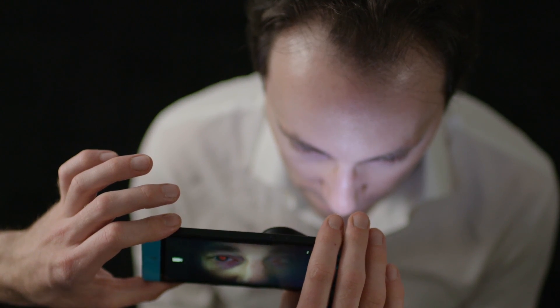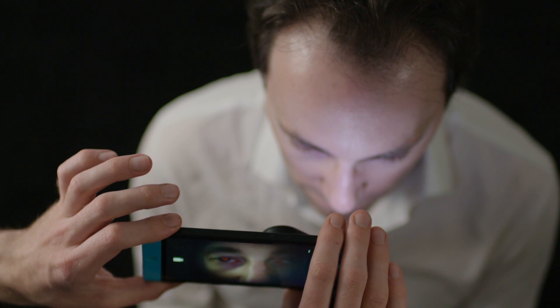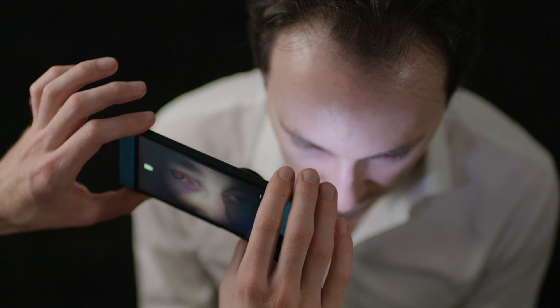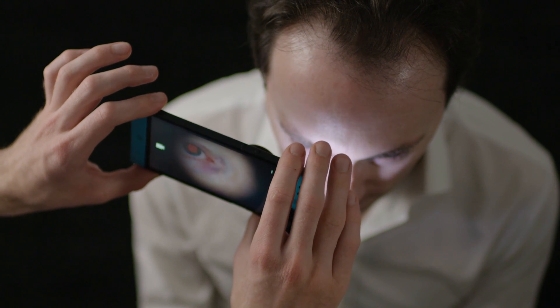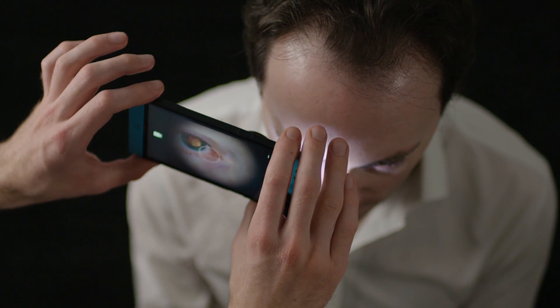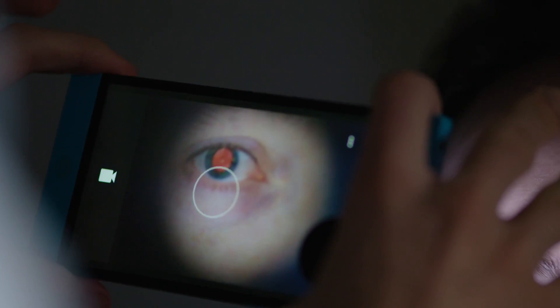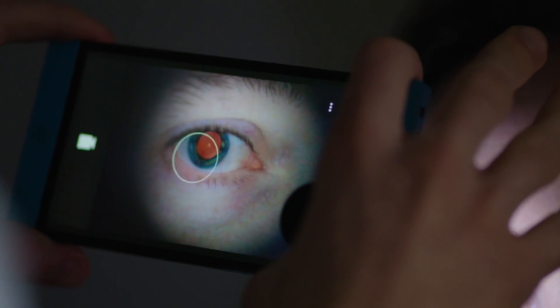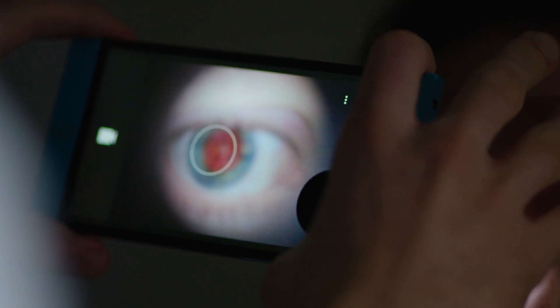Start 50cm from the patient. With the patient looking straight ahead, approach from a 30 degree angle. Ask the patient to focus on something behind you so that their eye keeps still. Move the phone forward, looking for a red-orange light reflex from the pupil. As you move in, keep the red light reflex in the centre of the phone's screen.